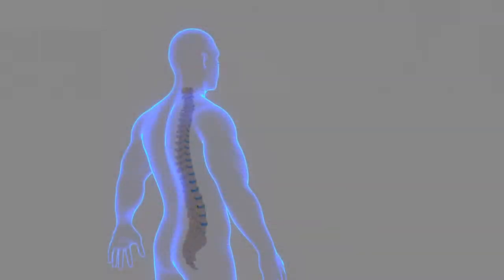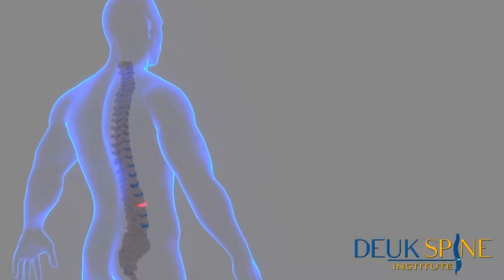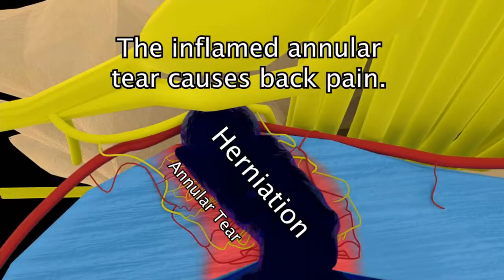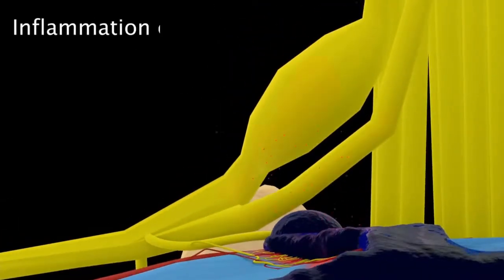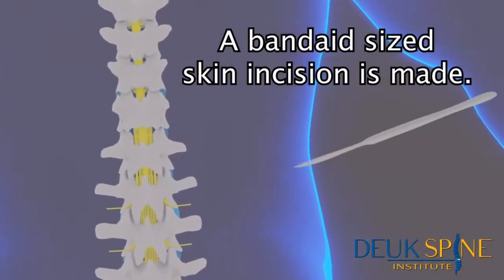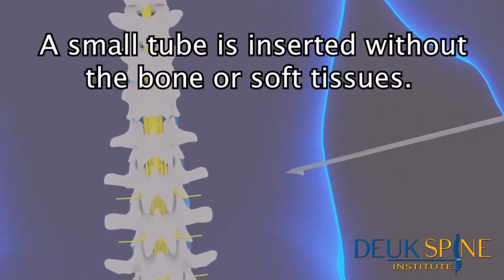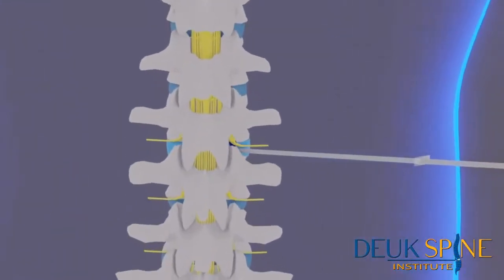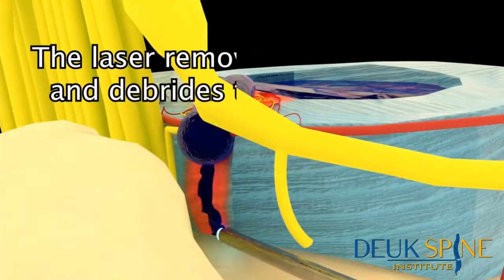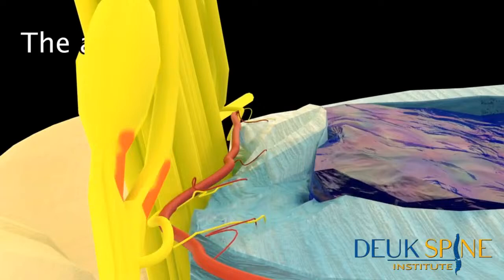All right, no complications. Disc herniations are a common cause of chronic back pain. This was a left DLDR, Deuk laser disc repair, L5-S1, and a left piriformis, which Dr. Patel did before I got here. Inflammation of the nerve roots causes leg pain. A Band-Aid-sized skin incision is made. A small tube is inserted without damaging the bone or soft tissues. The laser removes the herniation and debrides the annular tear. The annular tear heals on its own.